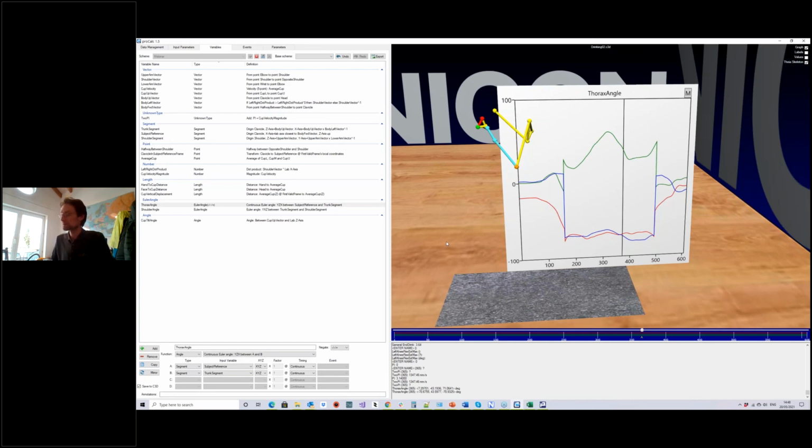The MP file is a very historical legacy file format that is still obviously used. I agree this is not an optimum solution, but it is the way it is, and unfortunately the MP file couldn't be used for the purpose of ProCalc.